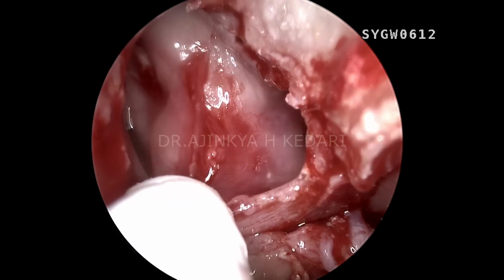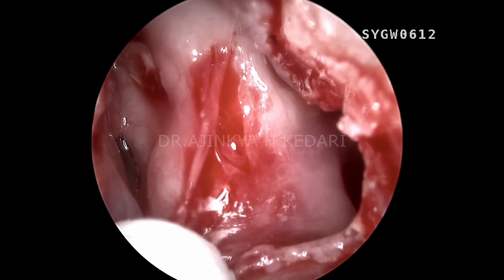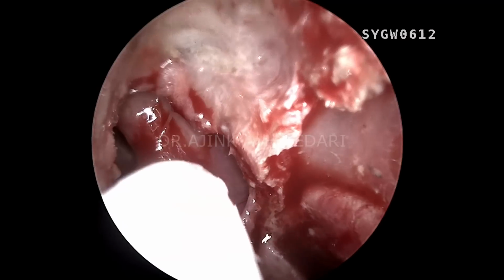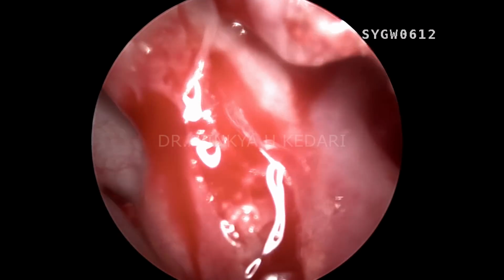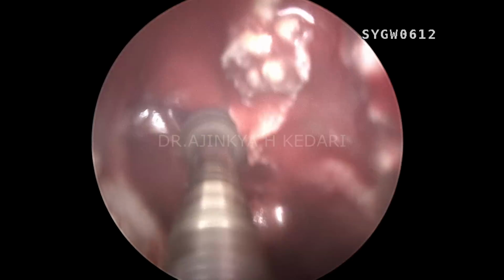You can see that's the complete posterior wall of the frontal sinus, very much in view right now. So you can imagine if we remove all that frontal beak, anything which is anterior to the cribriform, we'll have a very, very good exposure.